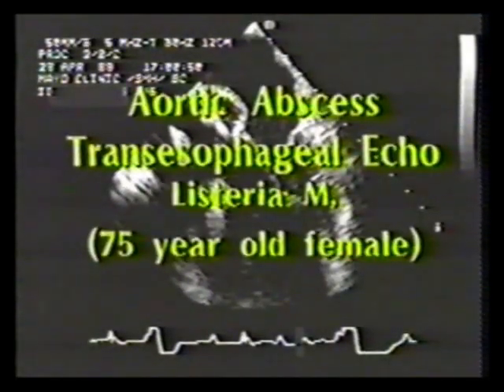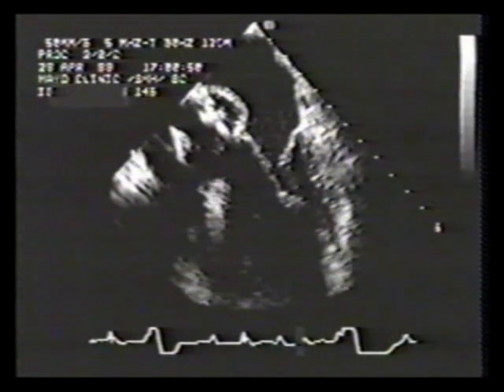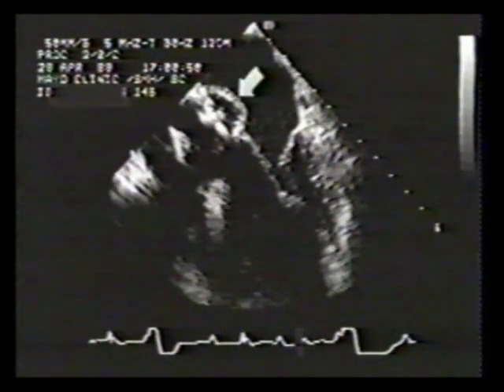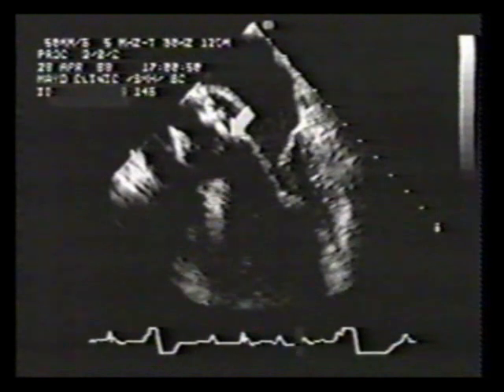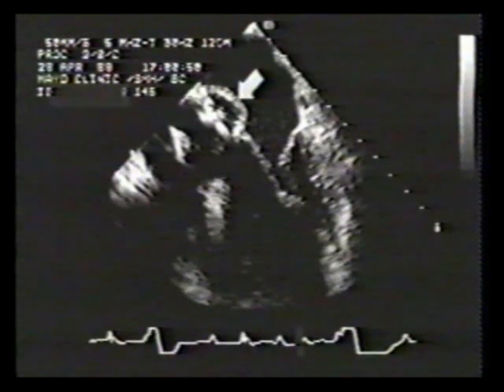This is a 75-year-old female with aortic root abscess secondary to infective endocarditis. Transesophageal echocardiography is considered the diagnostic echocardiographic procedure of choice. Transducer is adjacent to left atrium. Posterior to an aortic prosthesis is a cystic structure compatible with abscess. The refractal struts of the prosthesis are visualized. The abscess is posterior.